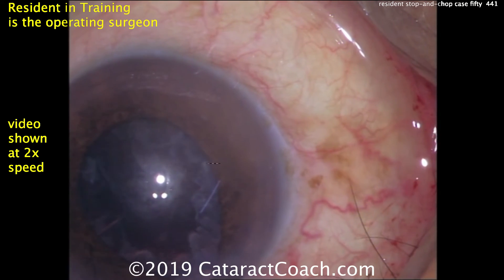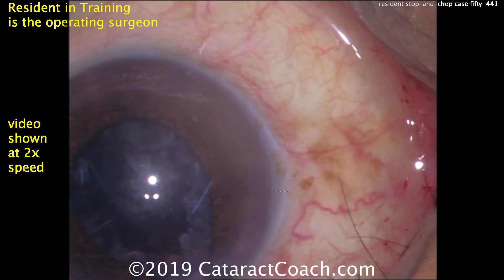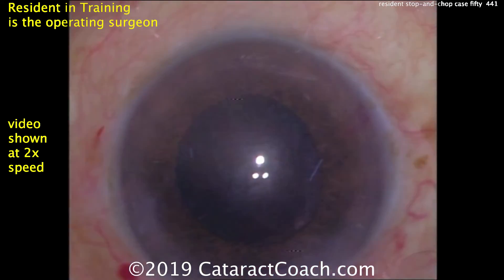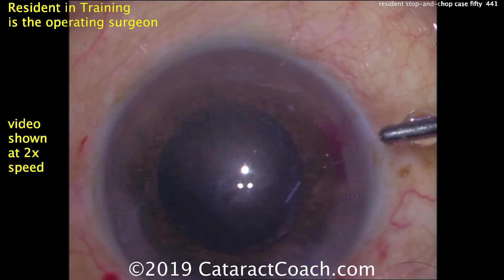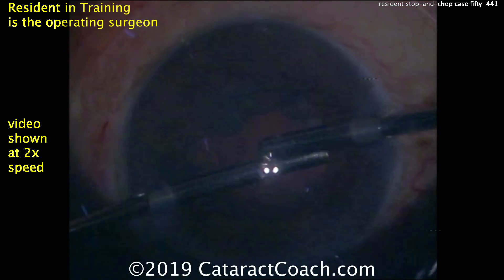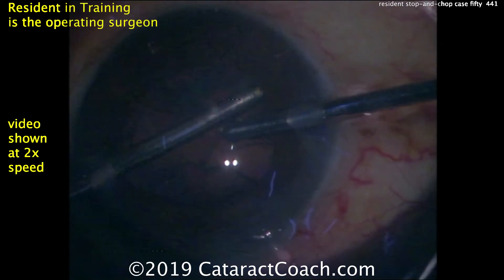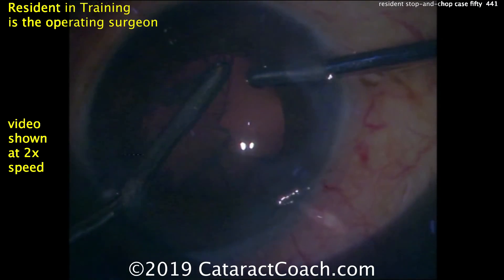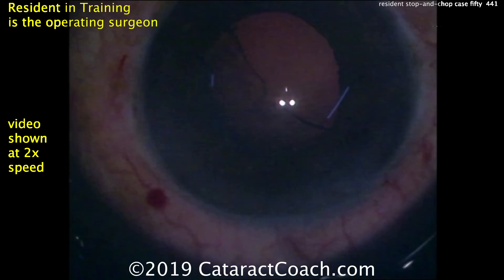For case number 50, this resident has done a beautiful job. There are some things that could be improved: I'd do a little longer tunnel length on the phaco incision, and the two paracentesis incisions I'd prefer to be a little more peripheral and barely nick the limbal vessels. The capsular rhexis control with just the cystotome was great. The stop and chop technique was done beautifully — the chopping part in particular went well. The microscope lighting has been adjusted to enhance the red reflex for a better view of the cortex material.